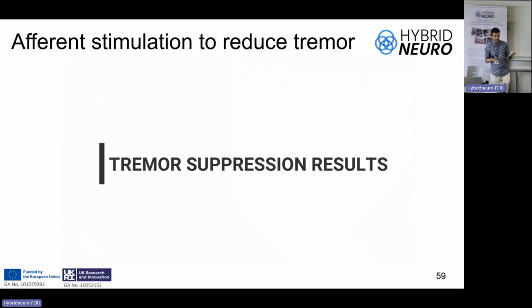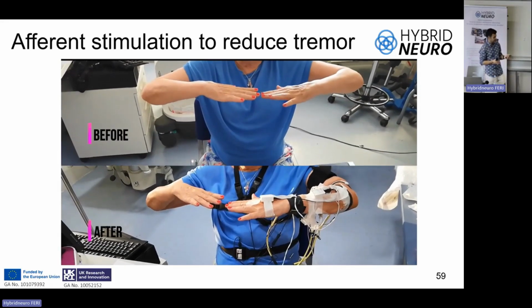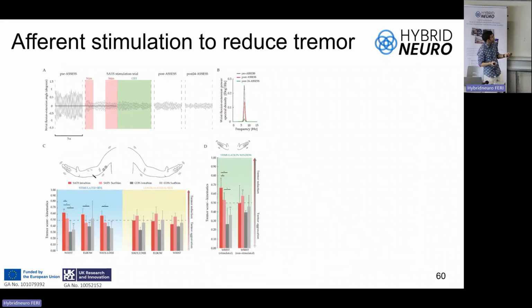We were looking for the acute effects, that's the truth. But we were surprised that for many patients, there was an after effect more pronounced than the acute effect. It's very difficult to draw conclusions in a small cohort of patients, but some of the results are really nice. So these are the acute effects results. This is an example of the pre and the post, so the tremor amplitude measured with kinematics is reduced. And the acute effects were quite subtle, but let's focus just on this one.